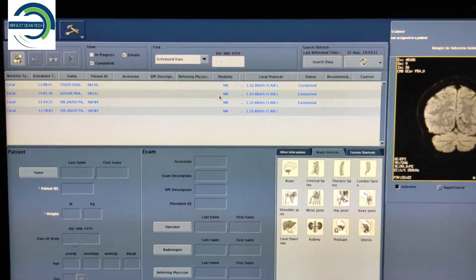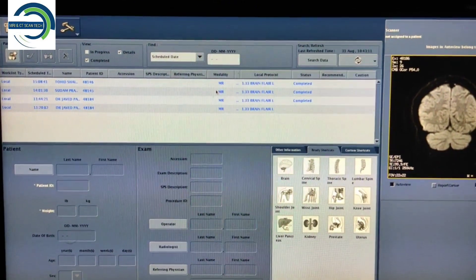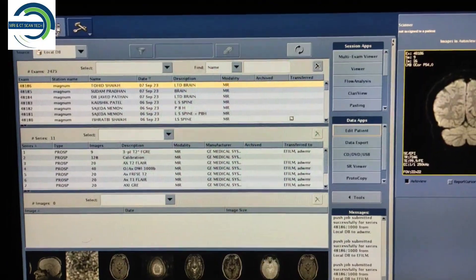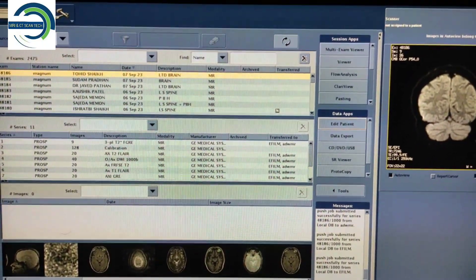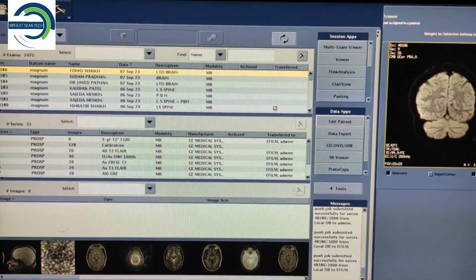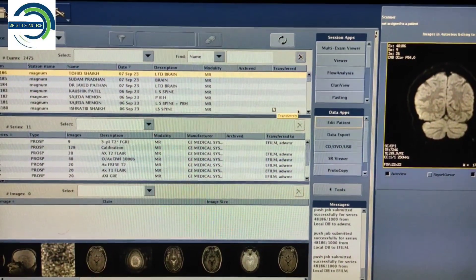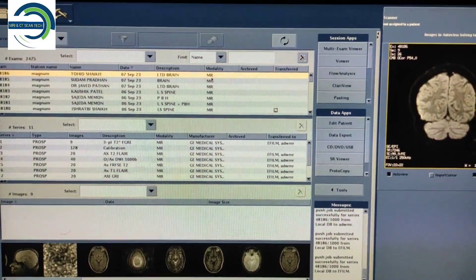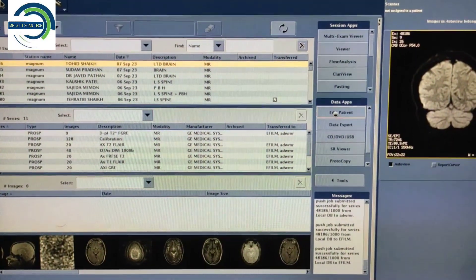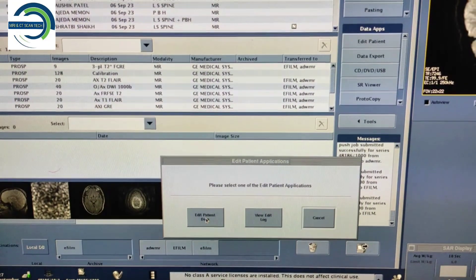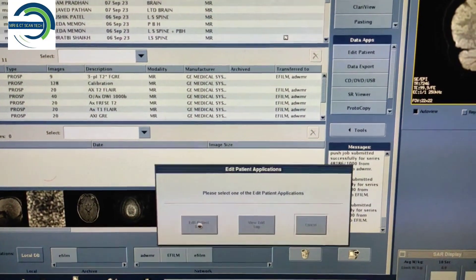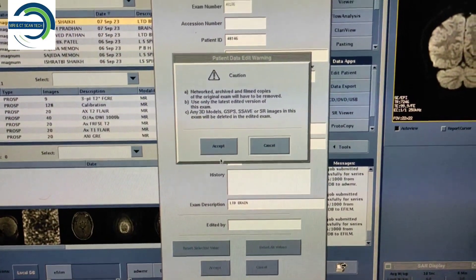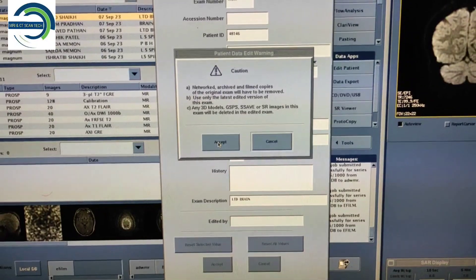Now the patient name was already in use, that's why we were not able to change the name. Now again I will click on the patient name and select Edit Patient, then Edit Patient Data. Now you can change the name of the patient.